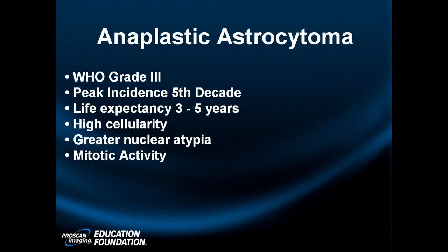A tumor can go from 10 centimeters to half a centimeter in 2 weeks. I know because it happened to my sister with a chondrosarcoma using a different kind of anti-vascular agent. So you're saying, well, that's great. If the tumor's shrinking and it's not enhancing anymore, how do I know that it's a fake response? And here's how you know. You've got other measurements of biological behavior, what we call biomarkers or bioendpoints.